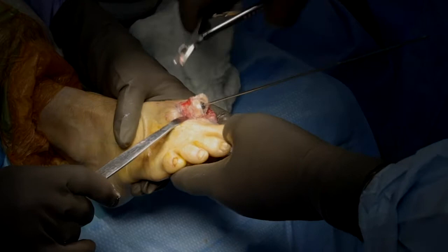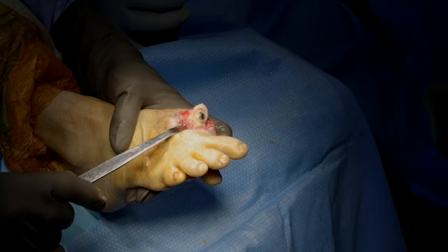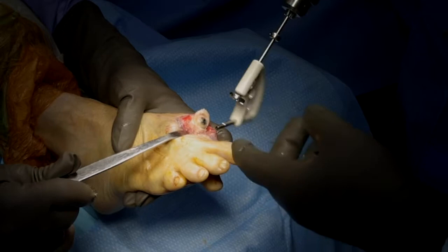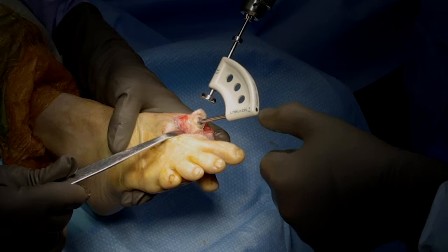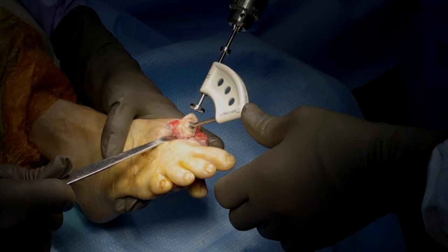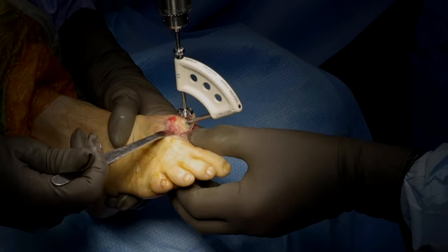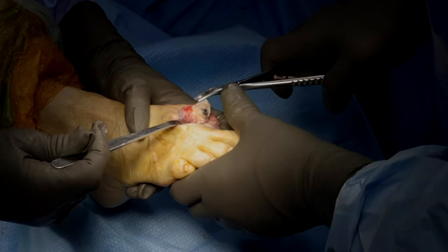I'm going to replace this whole area, so this is kind of my cheilectomy. I take this out and then use this reamer — checking it says 4.5, because there's also a 3.5 and you want to make sure you get the right one for the implant you're going to use. This also has a tapered post in this area, so I make sure that fits in first. Then I take my thumb and push right on this little silver dot to make sure the tapered post doesn't kick out. I rotate this around so I'm pointing at 12 o'clock, with the crista between the two sesamoids at 6 o'clock — that makes sure my implant is in a good position.